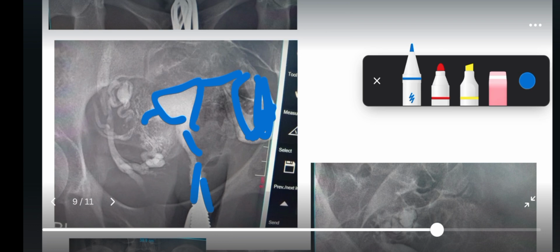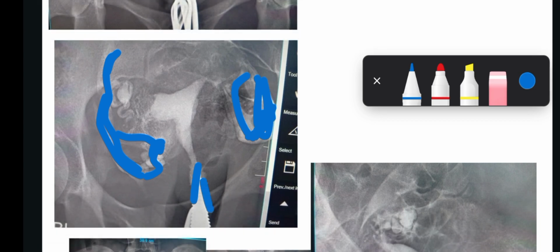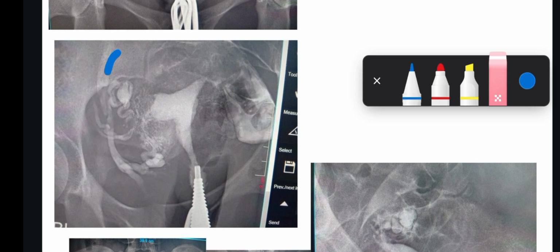Here we can make out something that is coming out from here and this, but we have so many other lines that we're seeing. These other lines are confusing. They are also a sign of intravasation, entering of the contrast into the vessels, which could also be as a result of doing the HSG at the wrong timing.